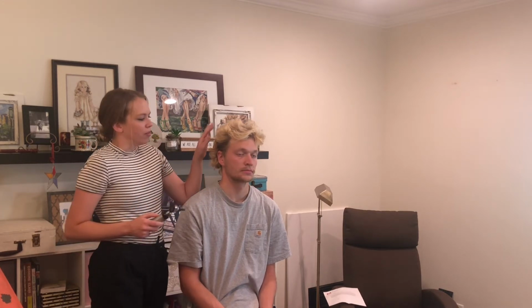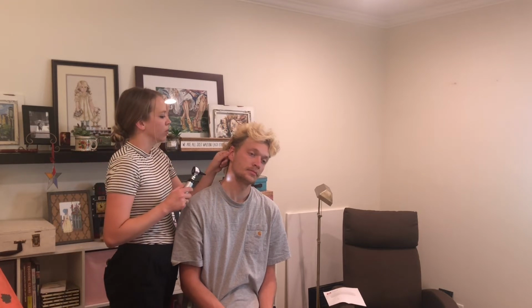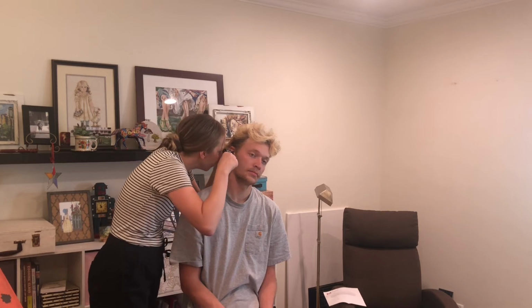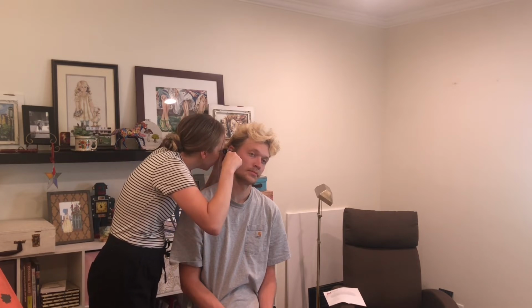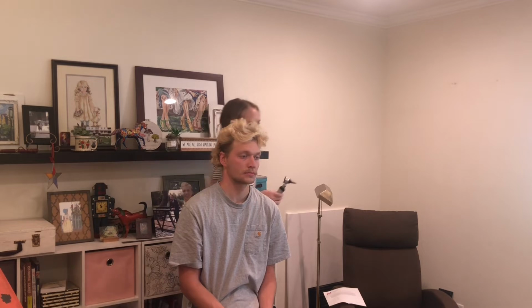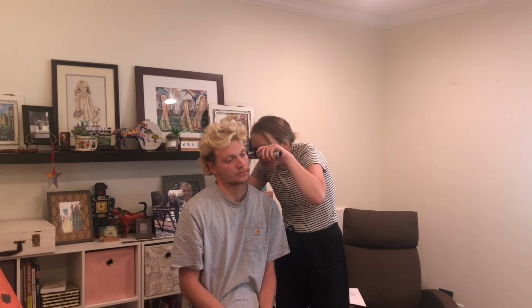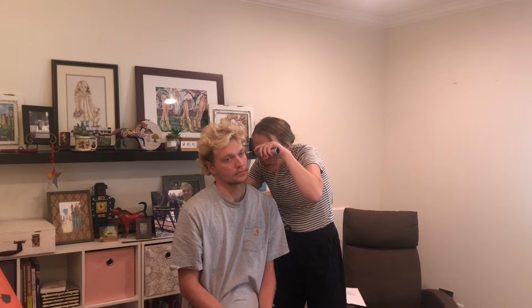And then we can have the patient tilt his head down towards the shoulder, and then we'll look at the inner ear with our otoscope so we can visualize the tympanic membrane. And same thing on this side. The tympanic membrane is a pearly gray. There's no redness noted.